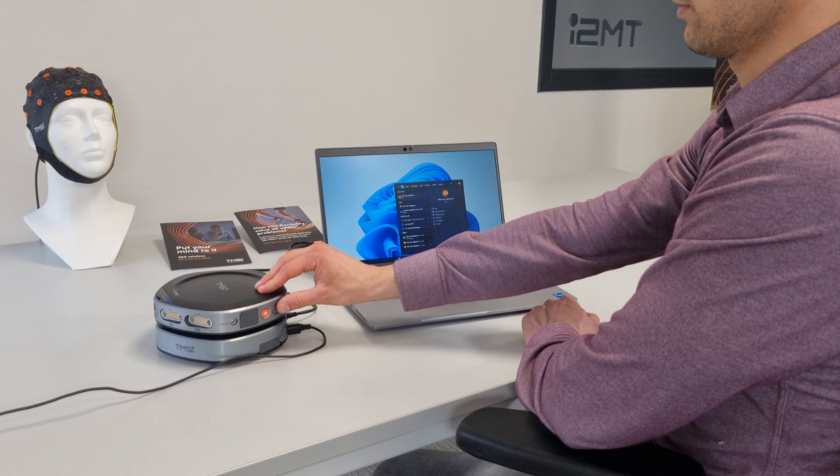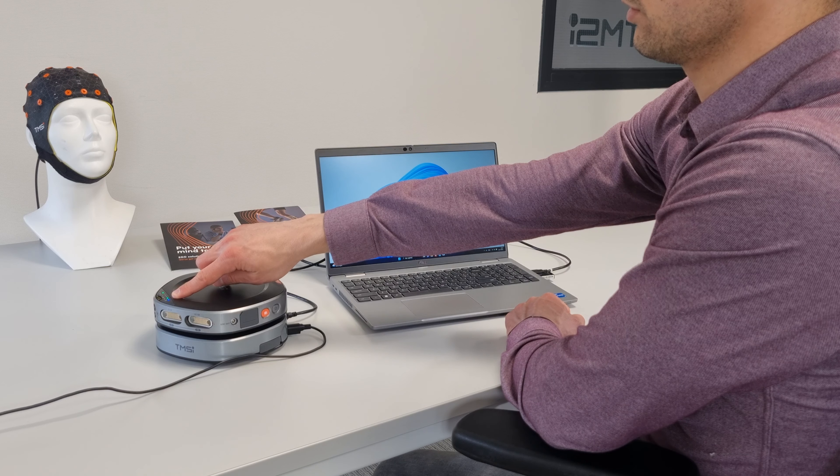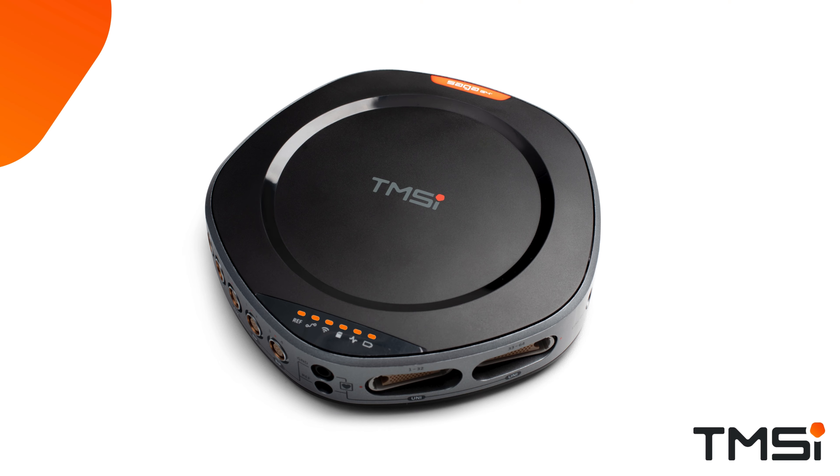Turn on the device by pressing the power button on the side of the data recorder. All LEDs of the data recorder will blink orange and turn off afterwards to indicate that the data recorder is turned on. Afterwards, the signal LED will turn solid green and the battery LED will either show solid blue if charging or solid green if fully charged.